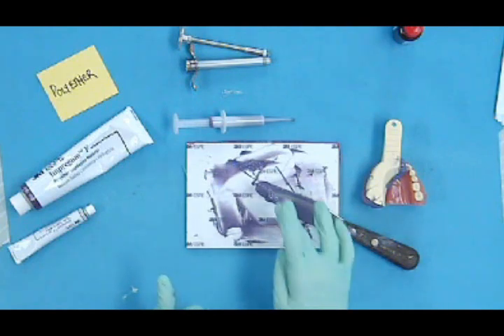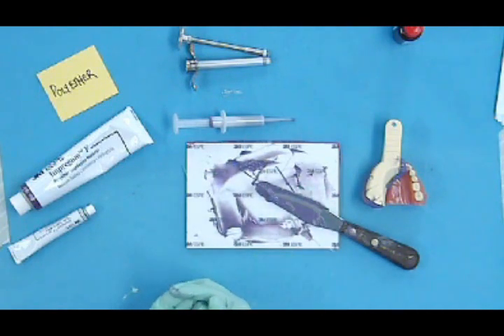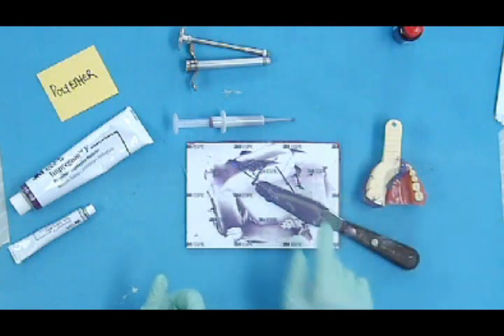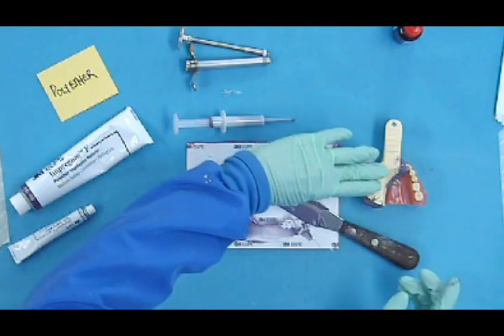Doesn't take quite as long as the polysulfide, but it still takes a little bit of time. And again, the dental assistant would be holding the tray in place.